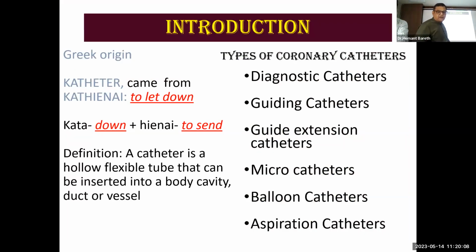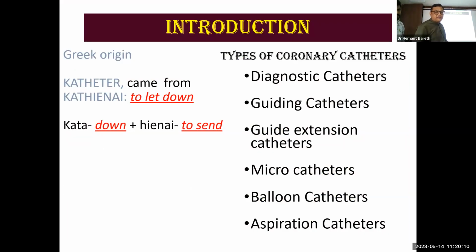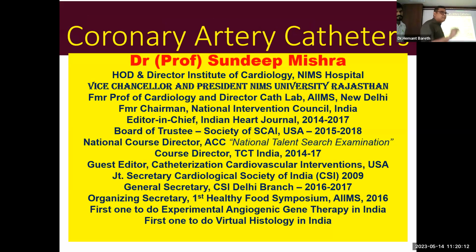Okay, good morning everybody. So today we will talk about coronary artery catheters. In interventional cardiology, the first thing that we touch is the coronary artery catheter. Catheters, as you know, are diagnostic and used for interventional purposes.